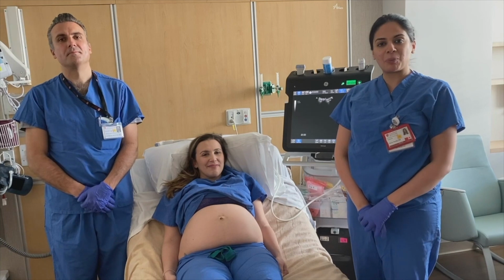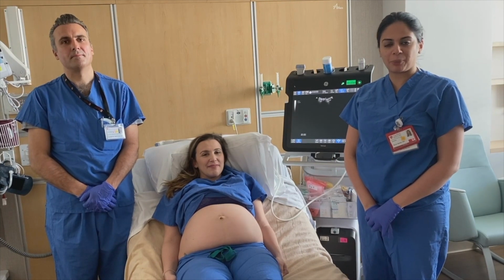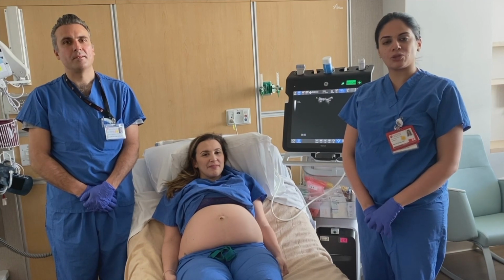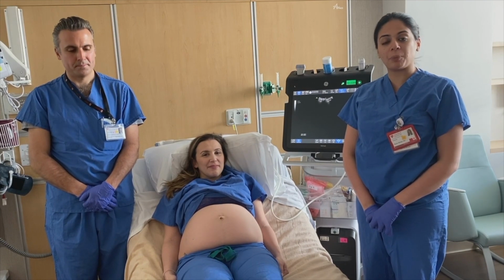Today we're going to cover point-of-care gastric ultrasound in the pregnant patient at term. The goal of the ultrasound examination is to rule out if the patient is at risk for pulmonary aspiration.